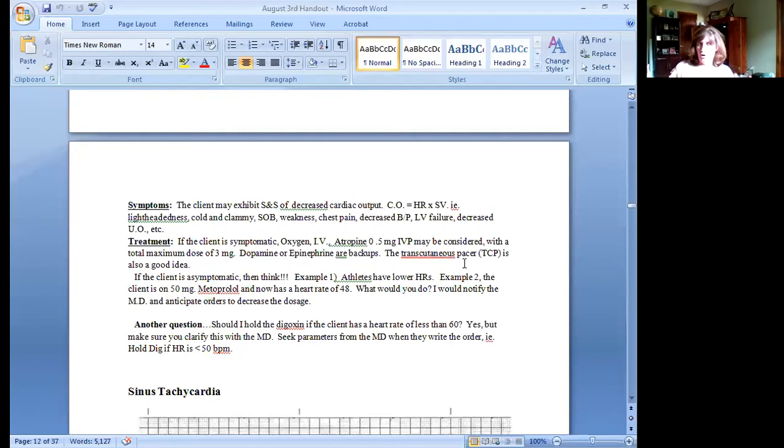On the top of the code card, which is in every unit, in CCU I can visualize 2 of them, there's a machine. And it's called the defibrillator, but I like to call it the 4-in-1 special because when we put the multifunction pads on the patient's chest, literally here, front, back, over the heart, and they're literally labeled front, back, we can hook those multifunction pads into the machine and do one of 4 things. Monitor the patient. Heck, we could defibrillate them. We could synchronized cardiovert them. I'll explain those 2 things in a bit.